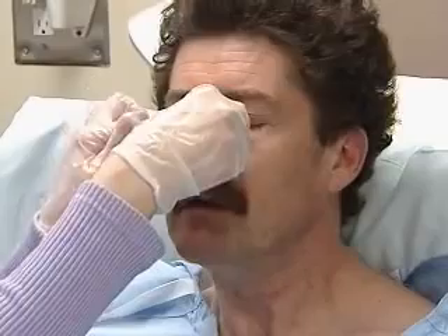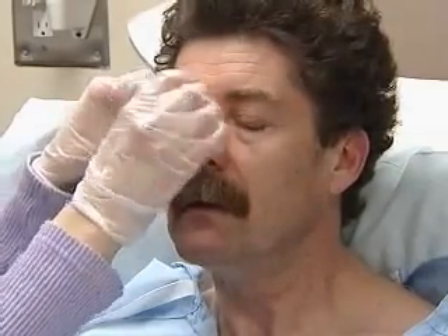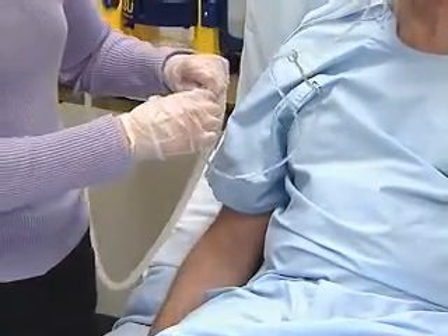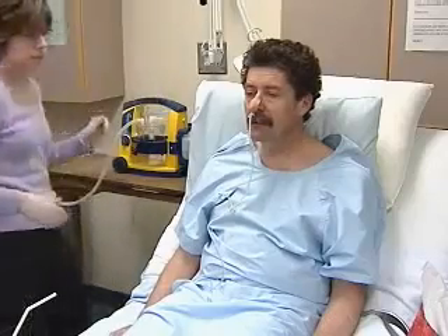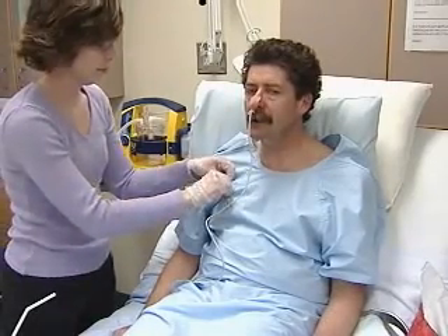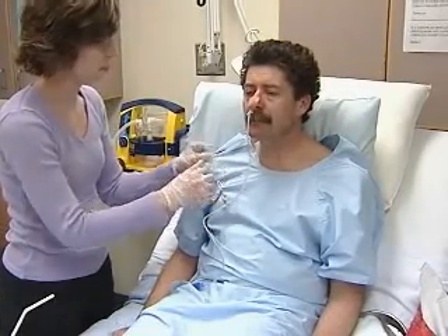Once you've verified the tube's placement, secure it with tape to the patient's nose. Clamp the end or connect it to a drainage bag or suction machine and fasten the end to the patient's gown. The head of the bed should stay at an elevation of 30 degrees to prevent reflux and to minimize irritation of the posterior pharynx. The patient should find the discomfort eases in a little while.